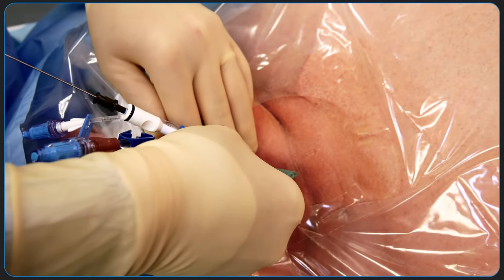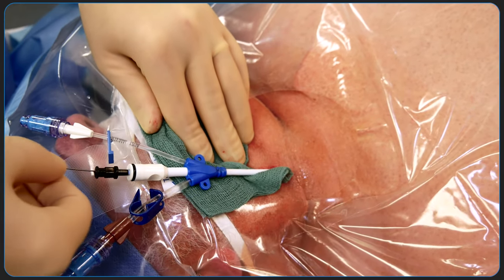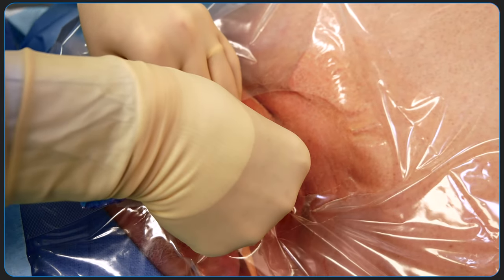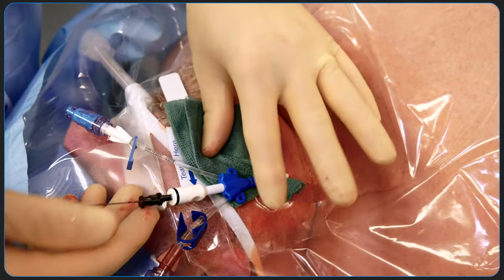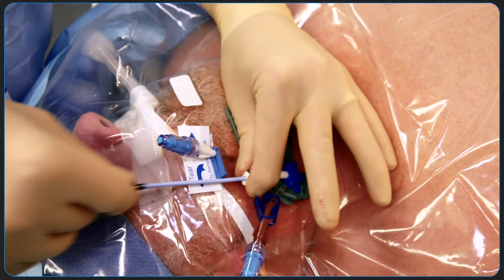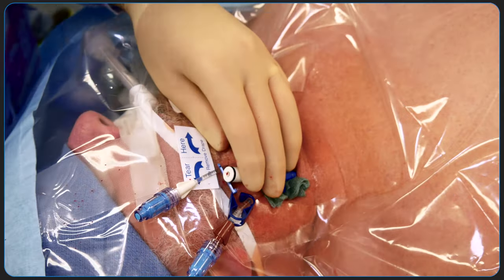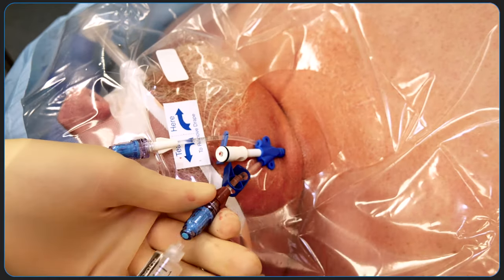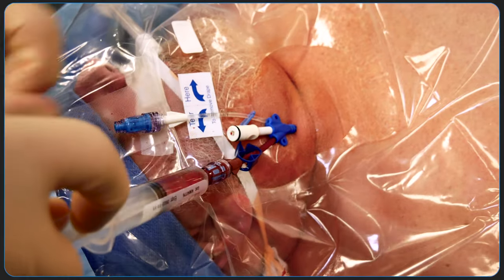Grasping the catheter and the dilator, the unit is advanced together through the skin incision using the alternate hand for counter traction. A slight twisting motion may be necessary. As the catheter is advanced, the guide wire is checked again before the catheter is advanced over the dilator into the tract. The dilator and guide wire are then subsequently removed together, and both ports of the introducer are aspirated and flushed with sterile saline.